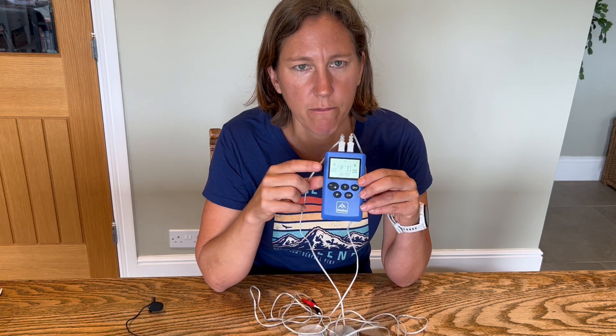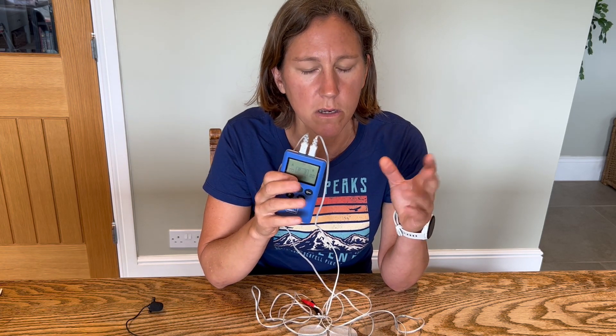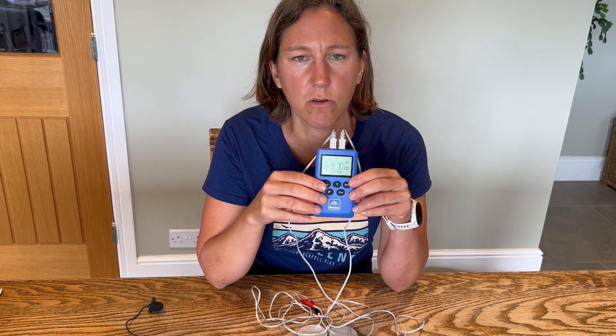They've chosen to use the alternating program, program three. They have both leads in, and that means that channel A will come on and stimulate the wrist and finger extensors, then it will rest, and channel B will come on and stimulate the muscle to lift the foot. The reason they've chosen this is it's a bit of a time saver because both muscles are going to be done in one 30-minute block, and for them it's more comfortable to manage than having both muscles come on at the same time, which you can do on some of the programs.